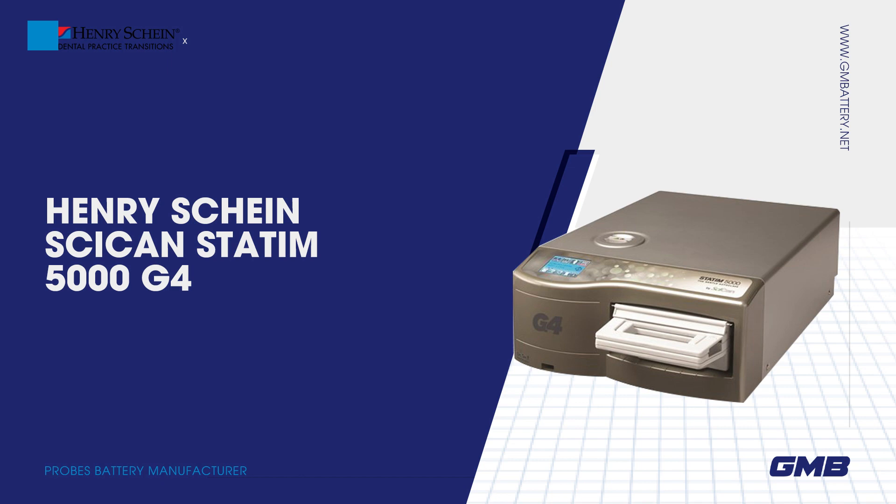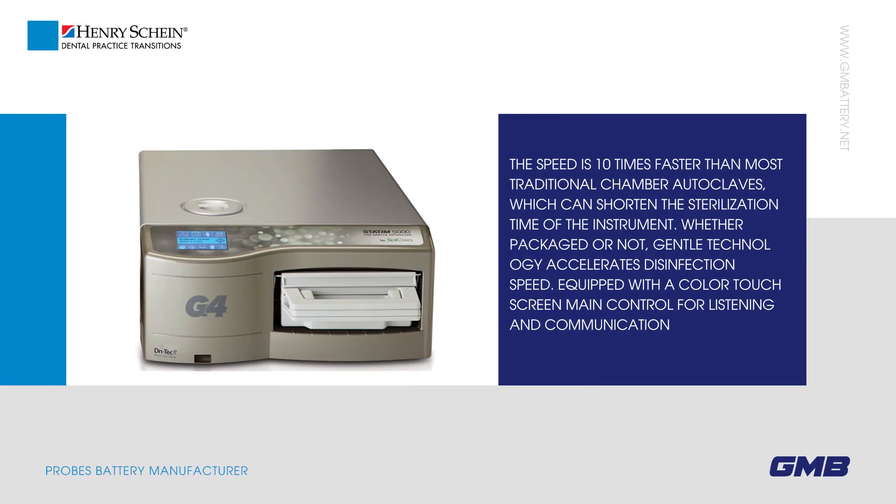Henry Schein / Scican Statim 5000 G4 — the speed is 10 times faster than most traditional chamber autoclaves, which can shorten the sterilization time of the instrument whether packaged or not. The gentle technology accelerates disinfection speed.